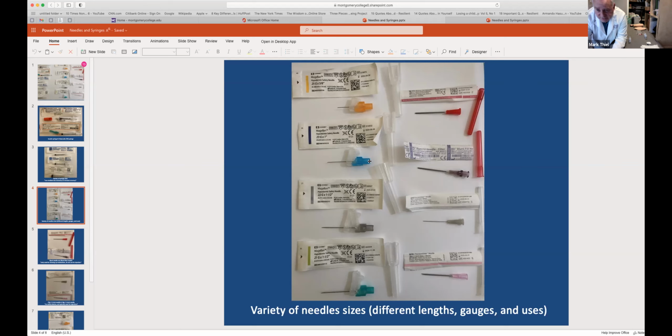Now, the second thing that I want to go through is needle selection that you will do as the nurse, choosing the needle in this particular case. And when I say choosing the needle, sometimes with insulin syringes and IV syringes, you don't get the choice of needle size. But in the intramuscular, you do. So, what size do we pick?